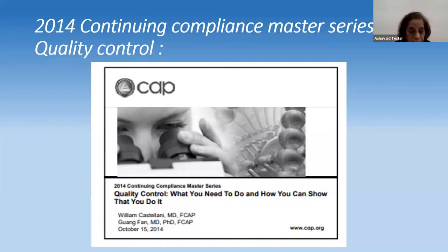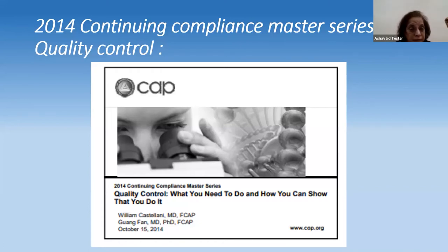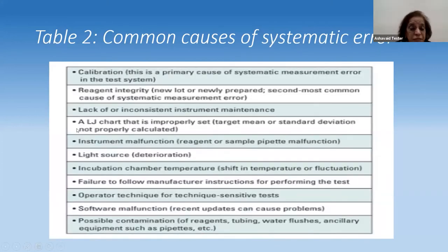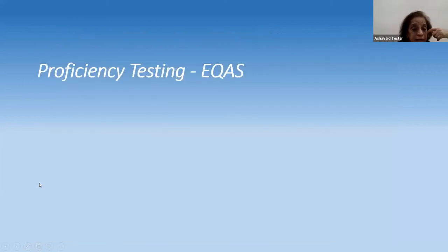There is a CAP document that covers quality control and how to demonstrate compliance. Common random errors and common causes of systematic errors are listed — you would go through each one to check if an error has occurred.